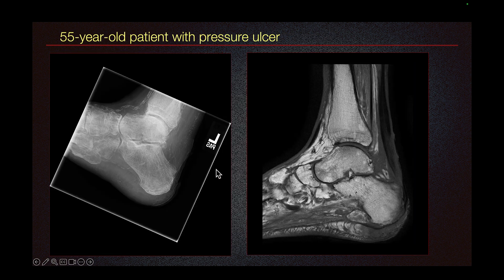I have another case of a 55-year-old patient with pressure ulcer on the heel. Here we can see skin irregularity corresponding to the pressure ulcer. There is subtle bone erosion here, which is a little bit difficult to see. Let's look at the MRI on the right — this is the T1 weighted image, and again this T1 hypointense marrow signal corresponds to osteomyelitis.